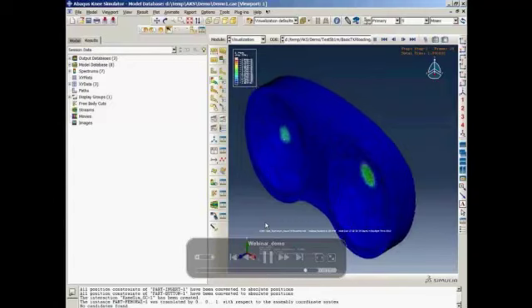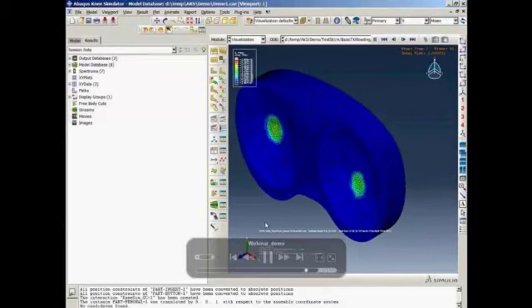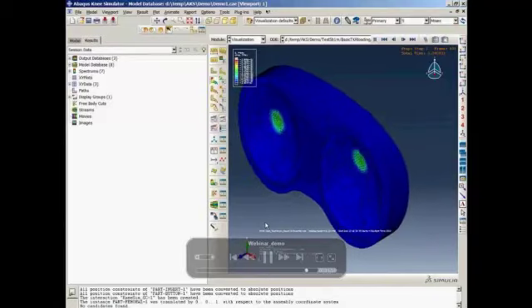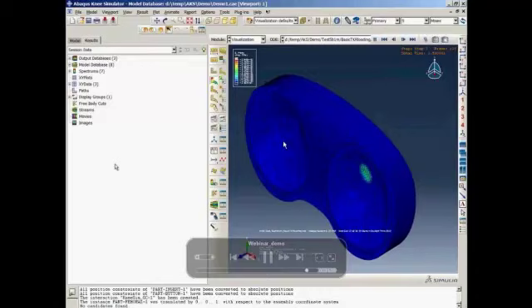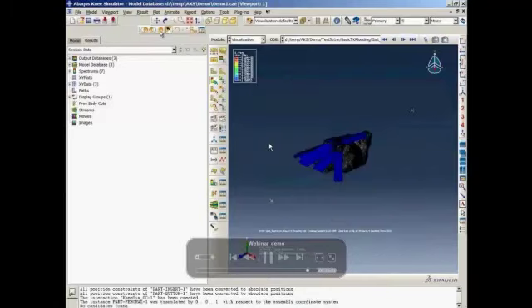And as I saw this result for the first time, I noticed that there was some lifting at the end of the gait cycle on the medial side. As you see here, the medial side no longer has any stress at the end of simulation. So I suspect there were some simulation options that triggered this behavior.